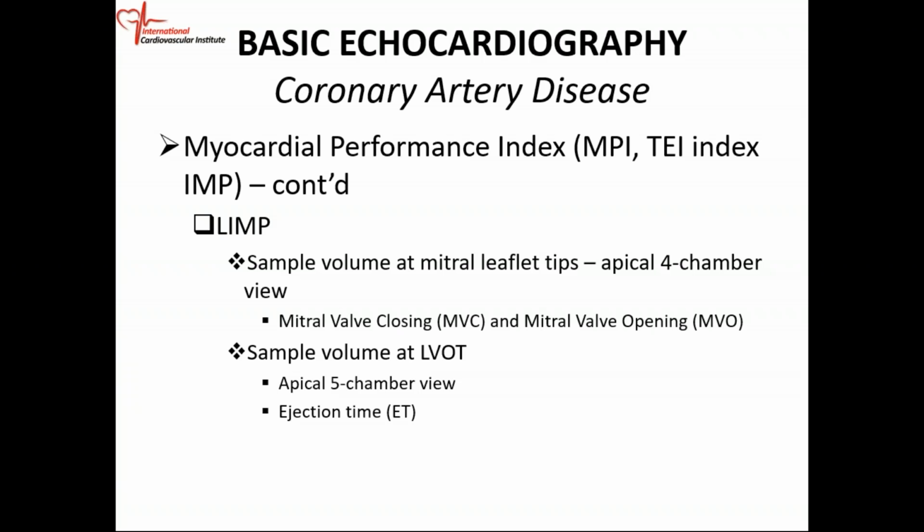So again, the definition is, and you have to use the Doppler, okay? You have to use Doppler to get a clear understanding of what MPI is. It is the interval from the mitral valve closure to the mitral valve opening.